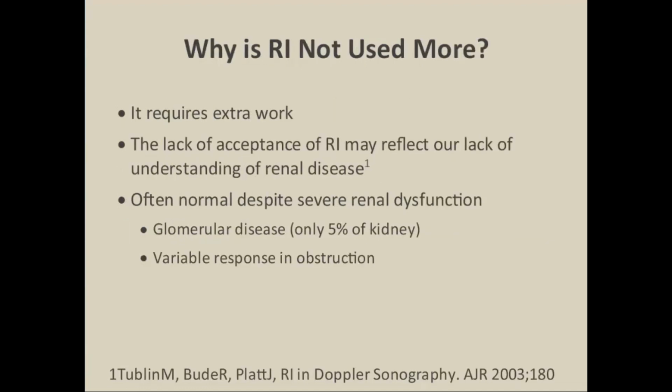Well, it's extra work. You know, basically you're not going to get more money by doing it. There's a lack of acceptance of RI, mainly because we don't understand how it is related to renal disease. We're not even sure exactly what it shows. It's a very difficult concept. It's often been proven to be normal in certain high disease states.